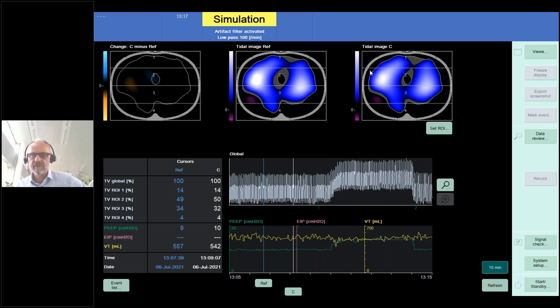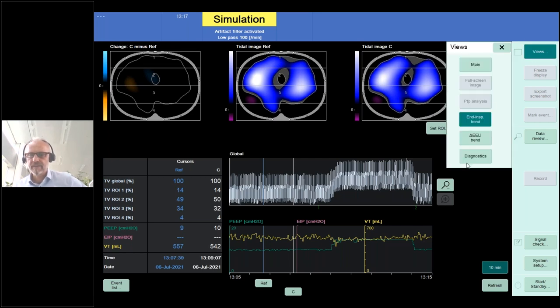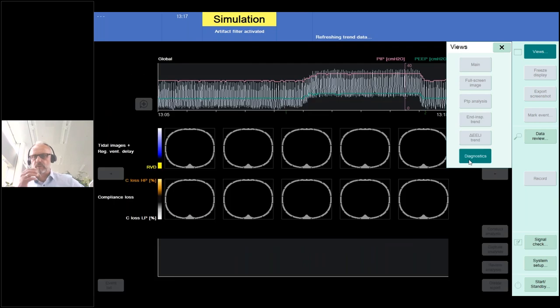It has a normal shape in the ventral part, in the ventral half, but in those regions here, it looks as if the lung was certainly not fully ventilated. So that is definitely something where we could do an assessment. I can predict already that this was also a non-responder, because I can slightly see here a purple spot, and that suggests that this patient had pleural effusion. I don't know about this part here, but I can demonstrate that right after the trend analysis, how that is displayed in the normal monitoring view.